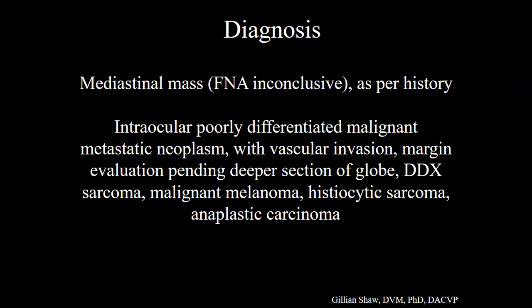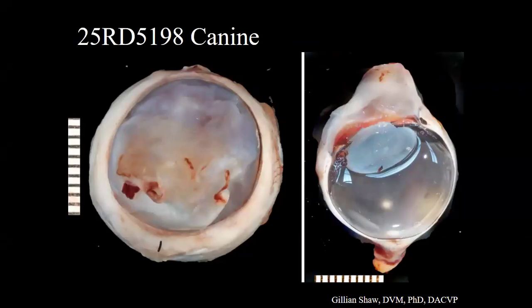Okay, on to something less dire. Well, not for the eyeball because we have it in a jar, but for the rest of the dog, probably. All right. This is an eye from a 10-month-old intact male mixed breed dog, which came with an interesting history. Kind of brief. They say acute corneal perforation from suspected spider bite or some other insect or animal during a walk at night with the owners. The duration, they said hours. So they enucleated very shortly after this happened.